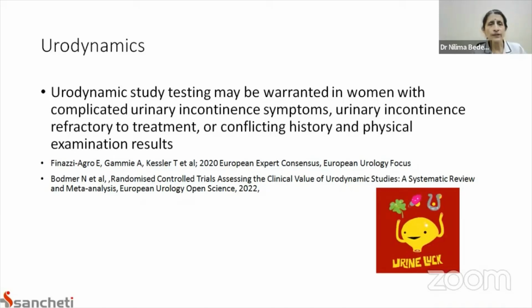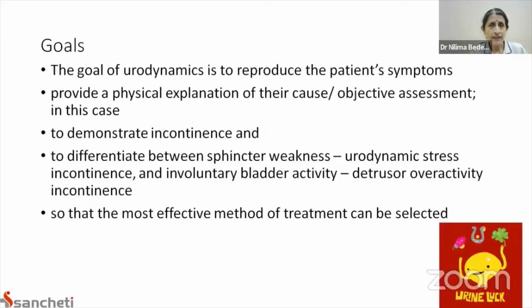So this testing is warranted where there are complicated incontinence symptoms and urinary incontinence which is not really managed with the treatment, or the person is giving conflicting history and physical examination results. There are various areas where only the specific urodynamic test will then be undertaken. The goal of the urodynamic test is to reproduce the patient's symptoms and understand them very objectively. This provides a physical explanation of the cause and an objective assessment.